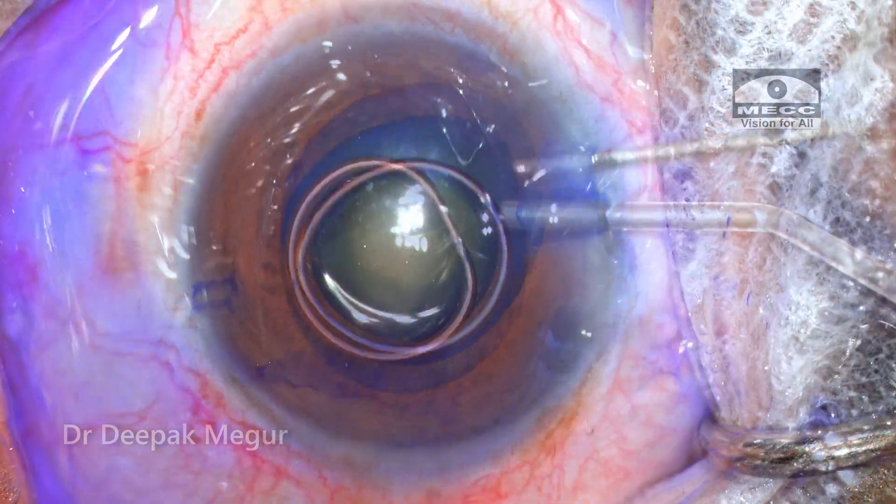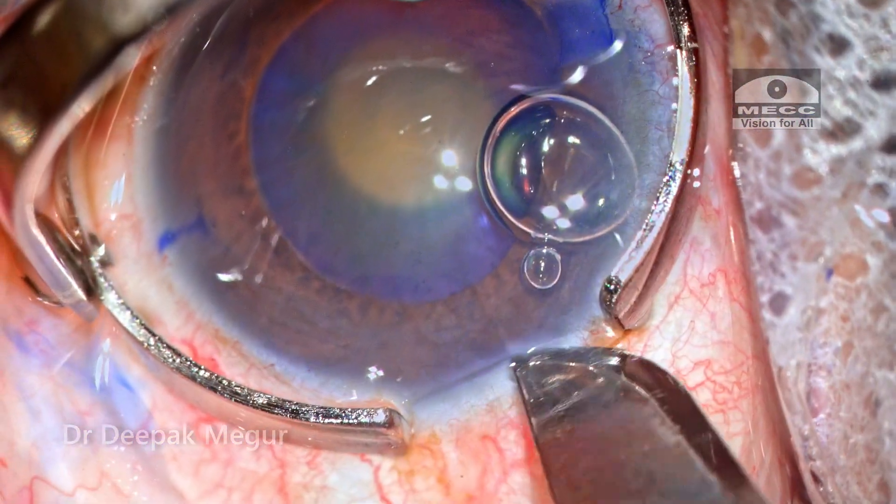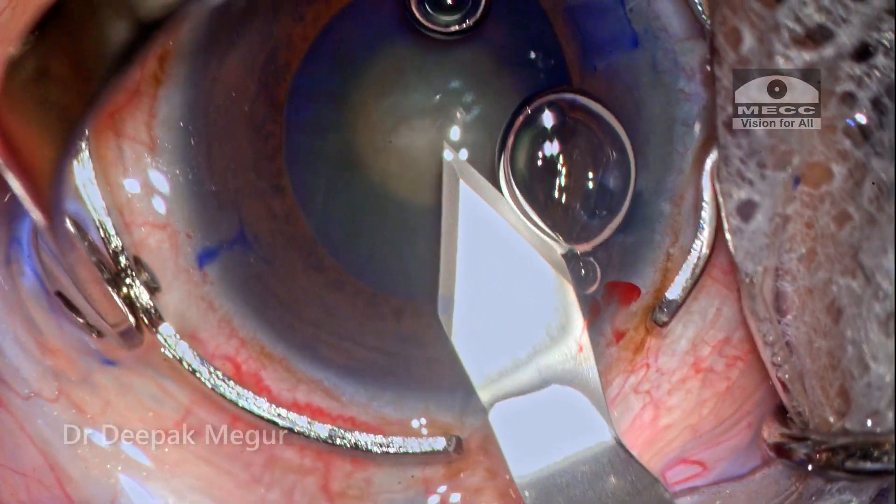I'm expecting some amount of zonular weakness in this patient. This cataract is also relatively denser — about grade 3 to grade 4 — and there is a general sense of lack of space in the anterior chamber. These are the thoughts going through my head.